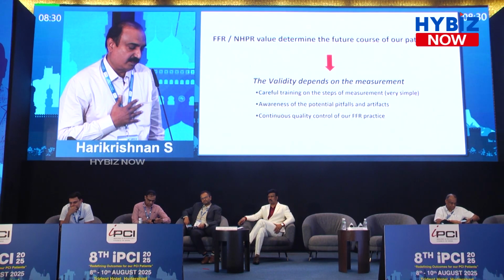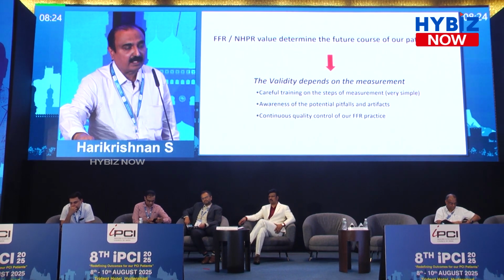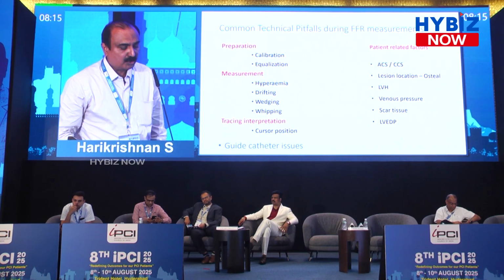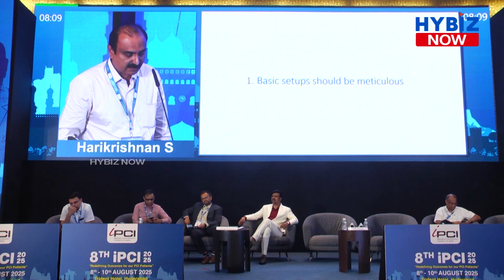And the non-hyperemic or hyperemic values determine the future course of the patient. So the validity depends on careful steps, which are very simple: awareness of the potential pitfalls and continuous quality control of your FFR practice. So there are common technical pitfalls, like technical factors and patient-related factors. Many of them have been discussed.